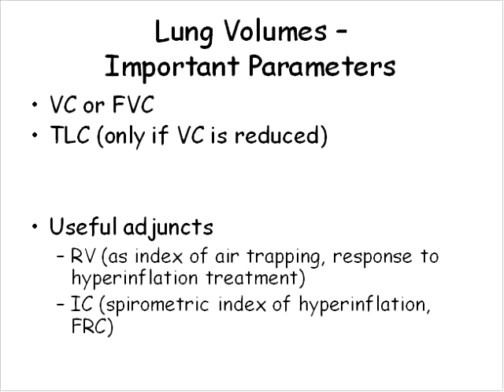So even without actually measuring residual volume, we can get a sense of whether or not the patient does have some sort of hyperinflation by measuring the inspiratory capacity. And again, inspiratory capacity can be measured just with a simple spirometer, and we make the assumption that if the inspiratory capacity is normal, the patient probably has a normal functional residual capacity. However, to really answer that question, we would have to measure lung volume. So inspiratory capacity has been suggested as a surrogate for actually measuring lung volumes, and in some instances that may be an appropriate thing to do.